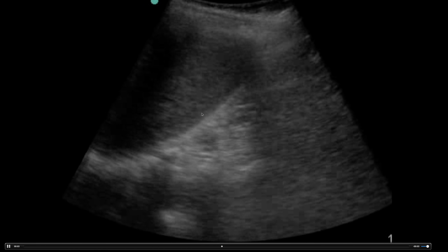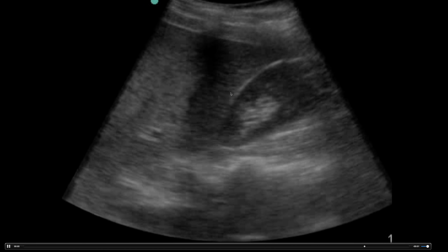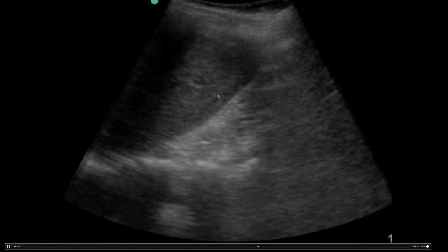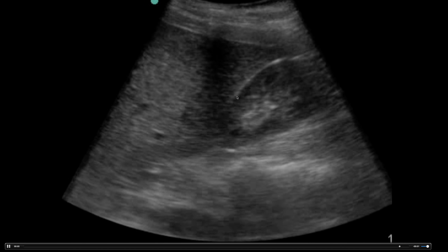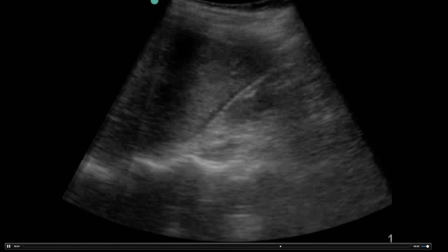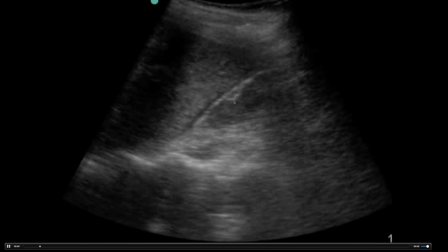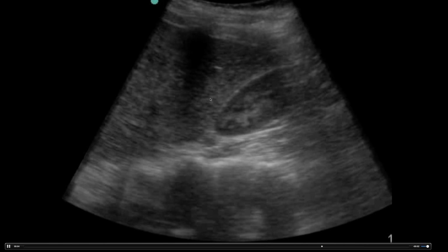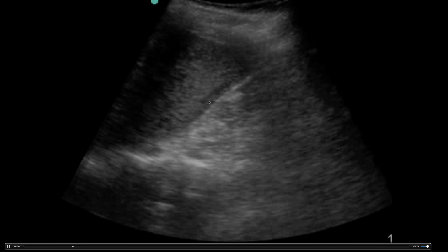There's this material here. It looks slightly less echogenic than the liver. Do you notice the difference? It's not that homogeneous liver. Could it be abnormal liver signal? Absolutely. In the right setting, however, if you have a trauma patient and they're unstable, especially if they had trauma a good amount of time ago, this would be suspicious for clotted blood.